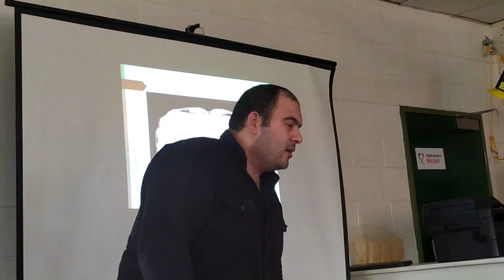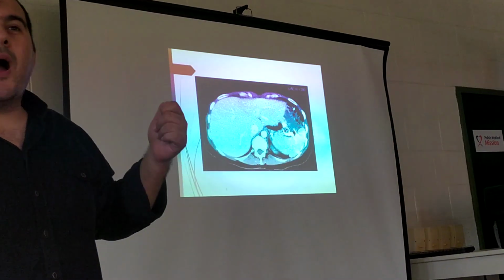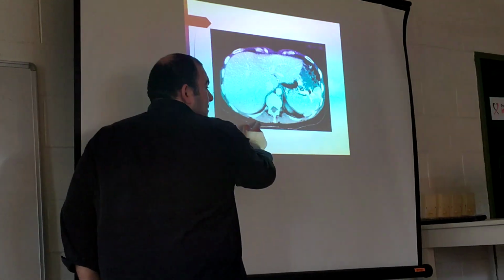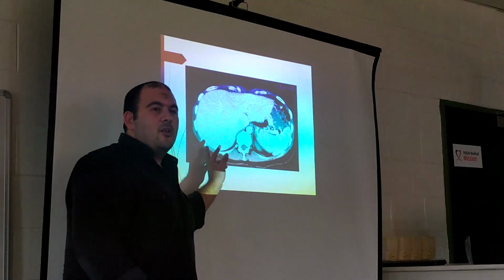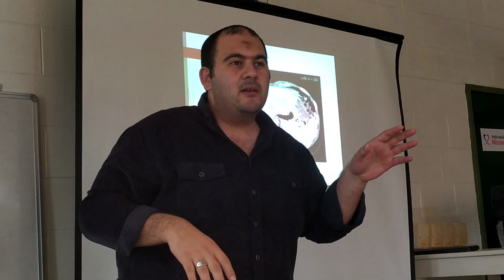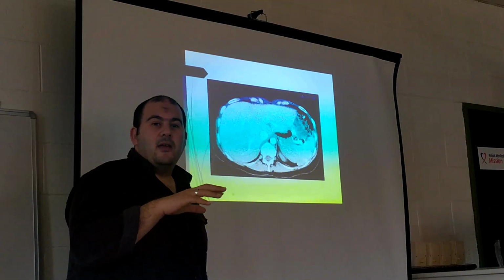Dense, more dense. This is bright signal, or white color. You will find here this area is subcutaneous fat. This signal is hyposignal or hypersignal? Hyposignal. Signal intensity here is low, and bone is high.